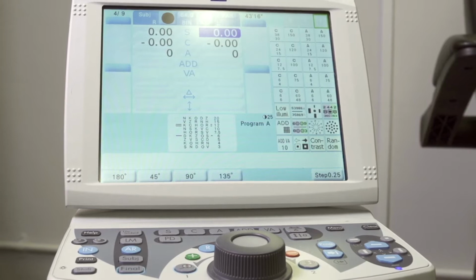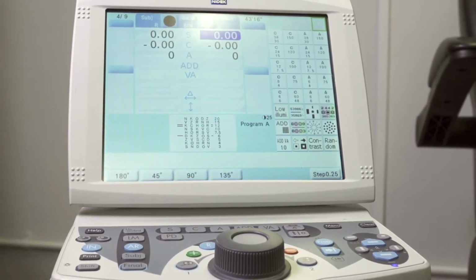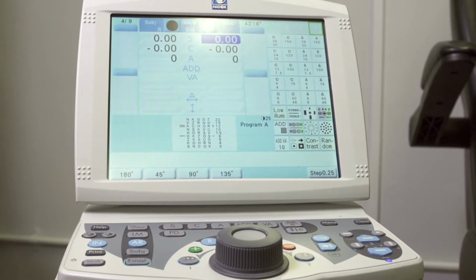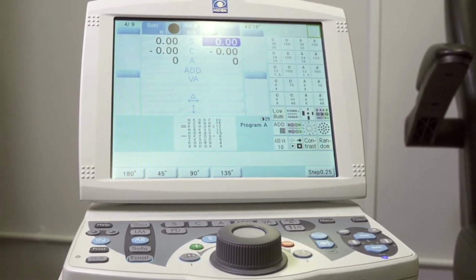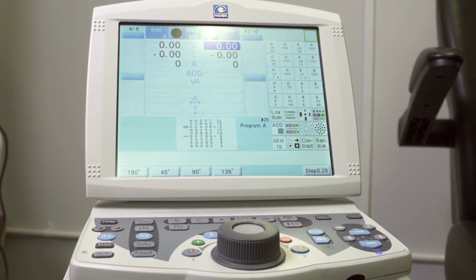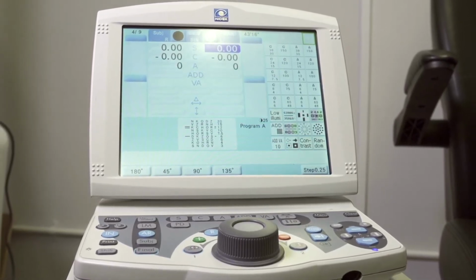The colour LCD control panel can be placed on a tower unit or on a tabletop to meet the demands of any test room. The screen is tiltable to improve practitioner comfort, whilst also allowing the patient easy viewing of inbuilt reading tasks and patient education tools. The user-friendly control panel allows a complete and easy refraction with inbuilt on-screen assistance to guide the practitioner as needed. The unit can be easily programmed to follow a refraction routine.